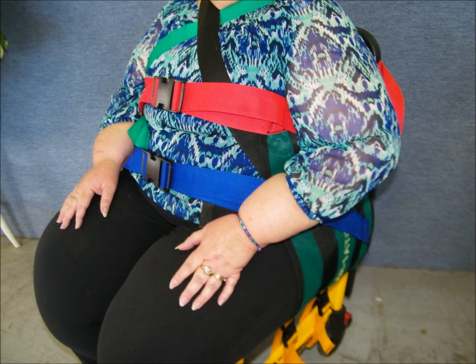Carefully place your patient on the stair chair. Bring the left and right panels up and connect the red and blue straps in front. Next connect the red and blue straps behind the patient. Tighten the red and blue straps to the desired tension and then re-check the frame straps.